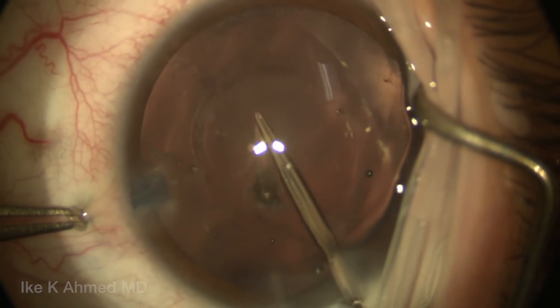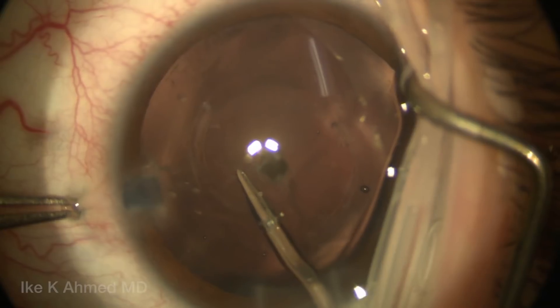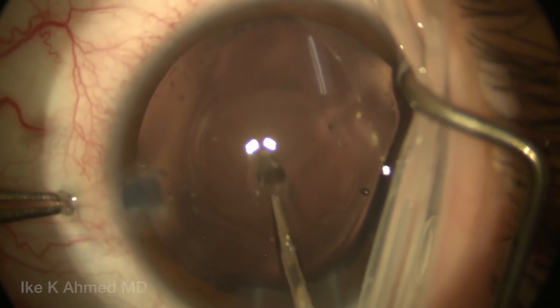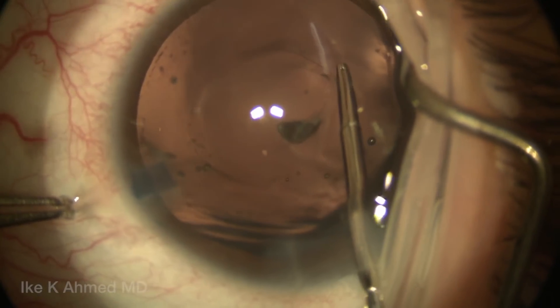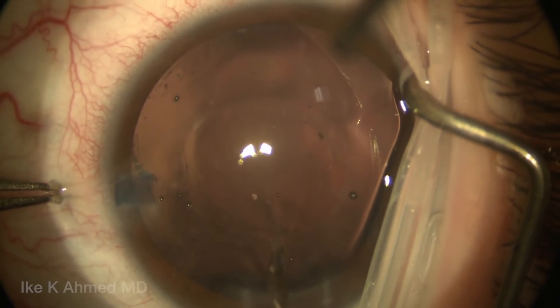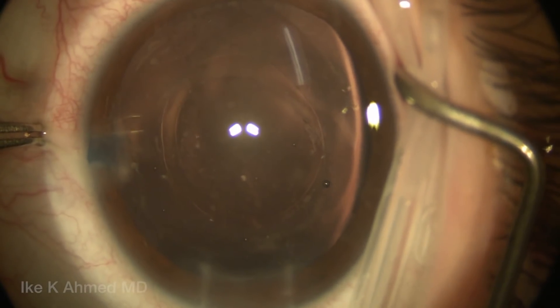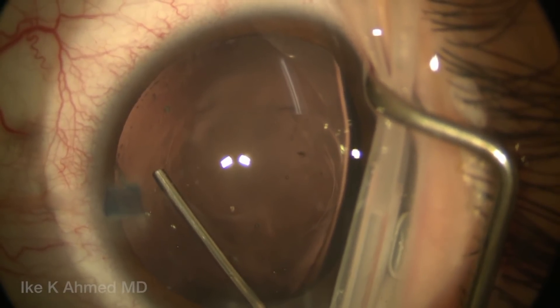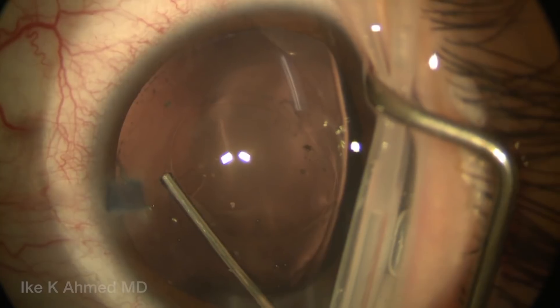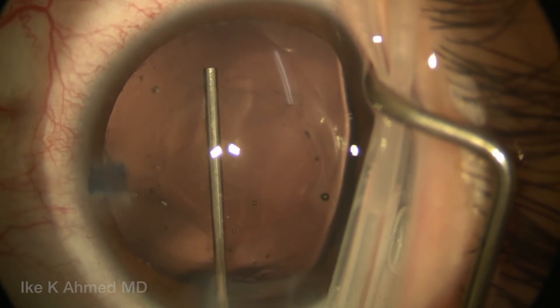It's important to make sure it's adequately sized because we are going to eventually end up capturing the optic of the lens through this posterior rhexis. A good 4mm to 5mm or so is important. We usually err on the side of making them a little smaller. You can see both the anterior and posterior capsular rhexis here, with the posterior rhexis slightly smaller than the 5mm or so anterior rhexis that was made.